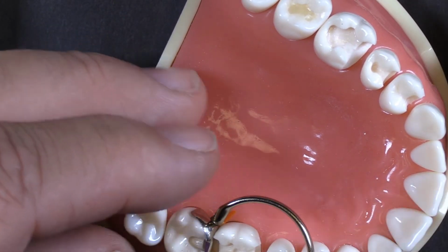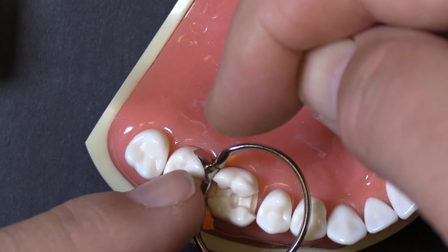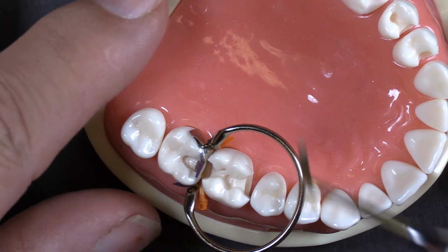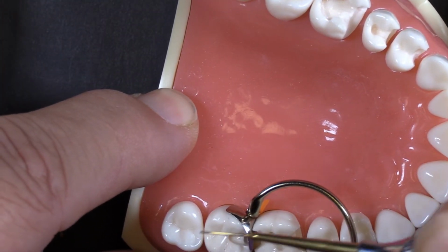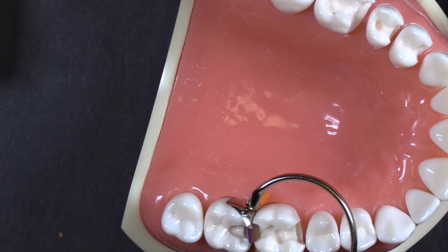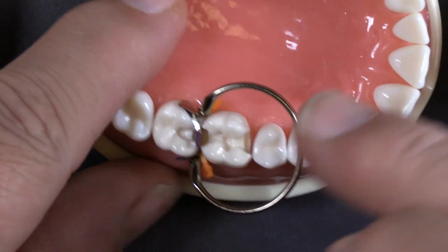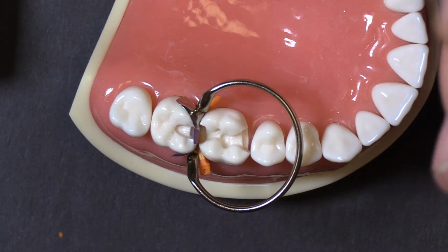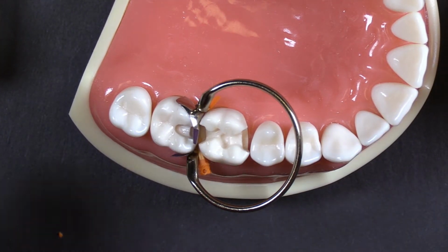That burnish can grab the band and push in and cause a pucker by the buccal and lingual margins. I don't know if I really achieved that with this, and it doesn't do it all the time, but certainly I've seen that happen very commonly, where I'm placing this style of ring, and the aggressive burnish on the tip will grab the band, pucker it in, and create a pocket on the buccal and lingual margins.